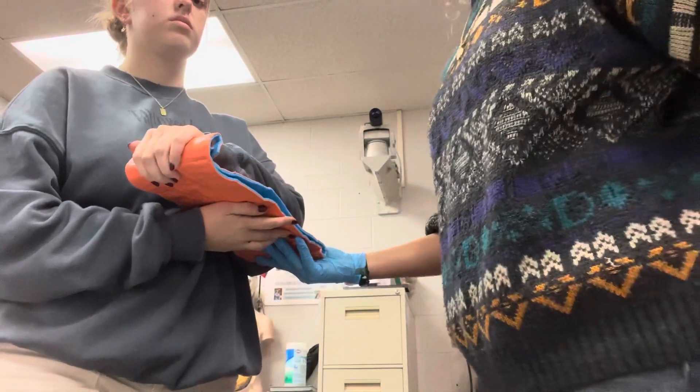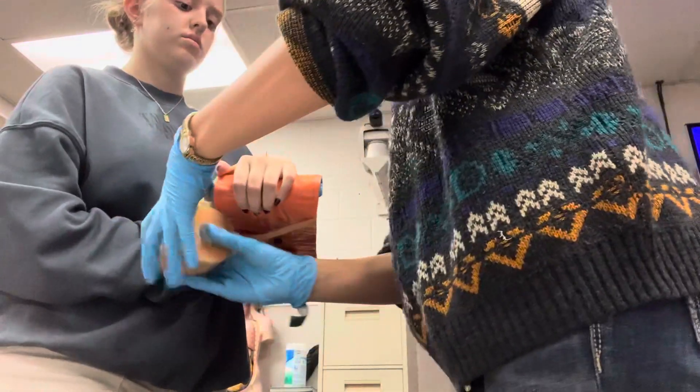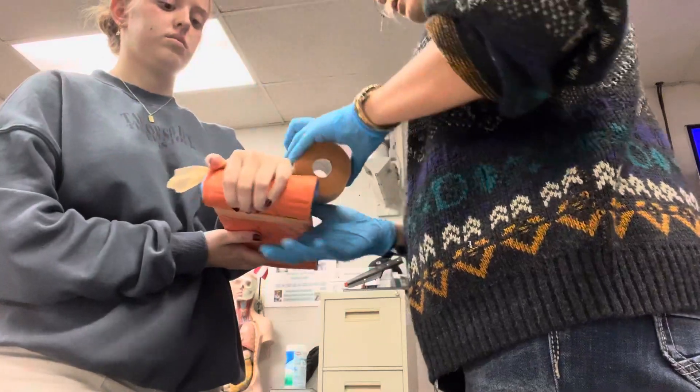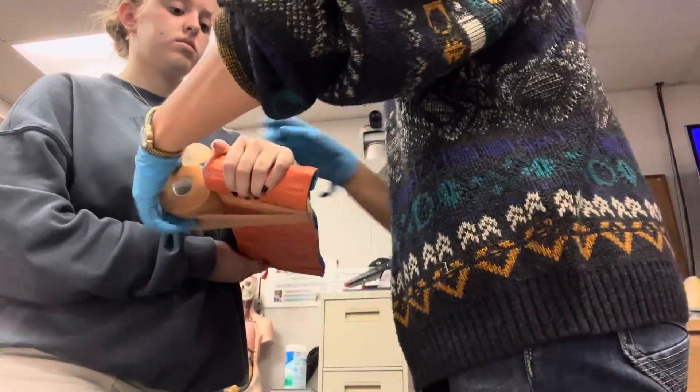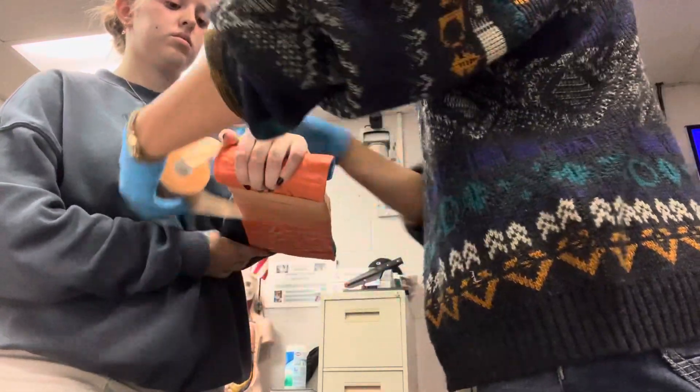Can I have you hold that for me, ma'am? Thank you. I'll take my wrap and place that underneath the thumb, making sure to immobilize her arm, leaving room to check for CMS later on.